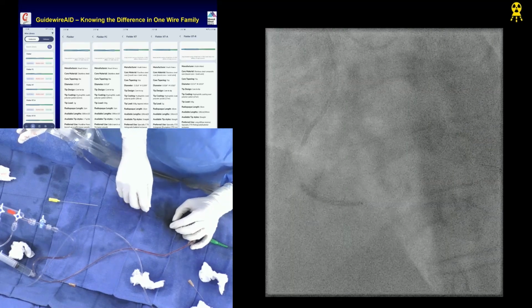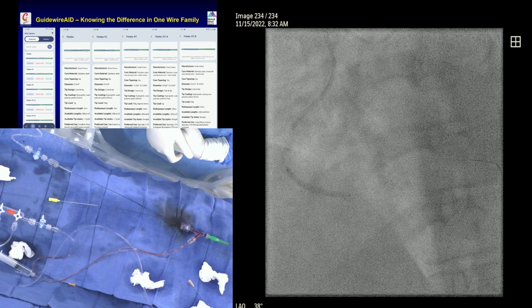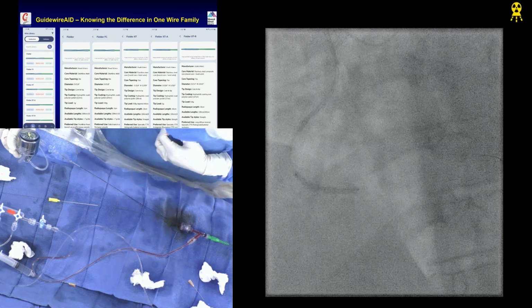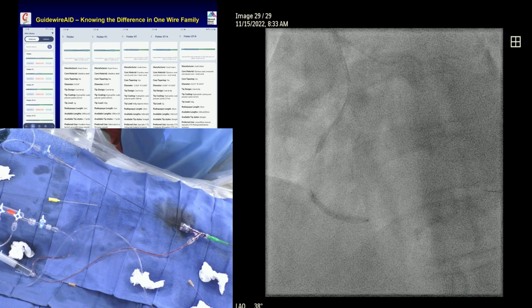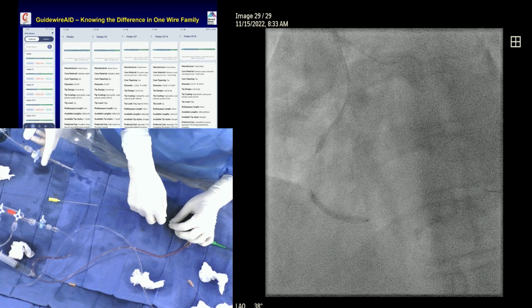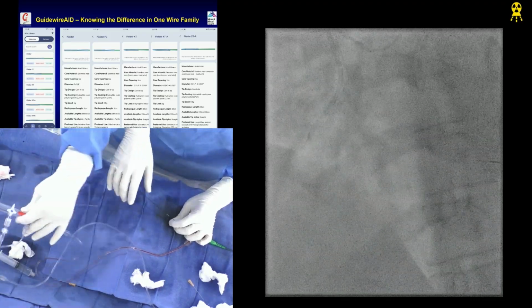Okay, good. Down. Pull your guide back out a little bit. Okay. You want to place a stent here. The guide keeps getting sucked in deeper and deeper. We are going to stent that lesion while coming out. Now, about a 30% lesion there, 30, 50. Where's my Miracle? Is it still good, or do we need a new one? Get me the Fine Cross and Miracle, and then I may need that to go into the side branch. Okay, ready? Let's take a picture. Antegrade now.